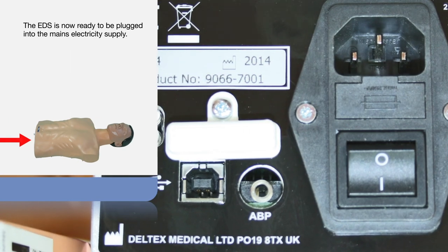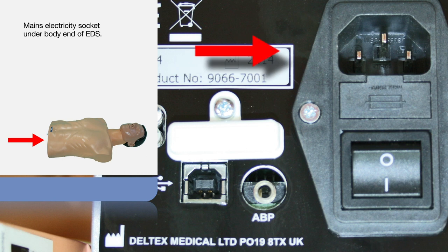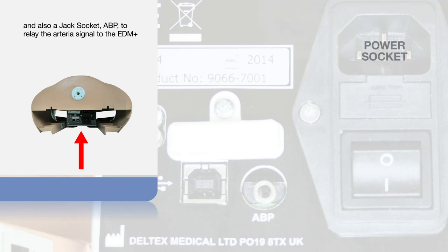The EDS is now ready to be plugged into the mains electricity supply. Look underneath the end of the body. Here you will see a 3-pin socket for the mains electricity supply cable, and also a jack socket to relay the arterial signal to the EDM+.